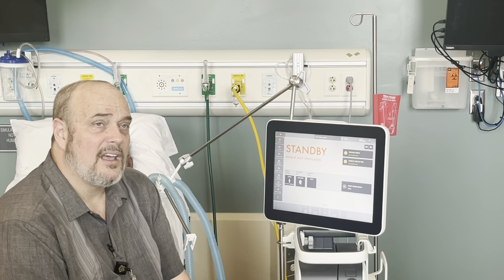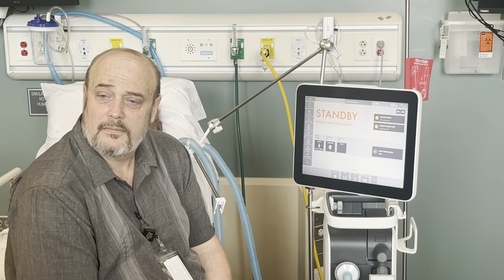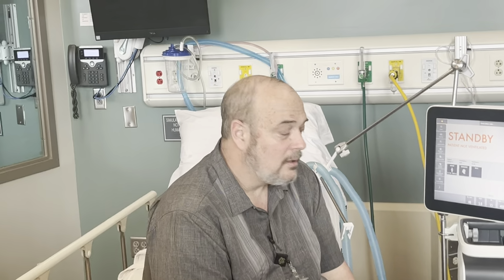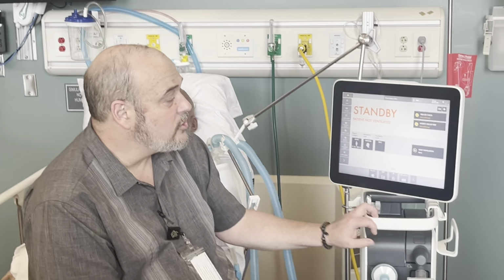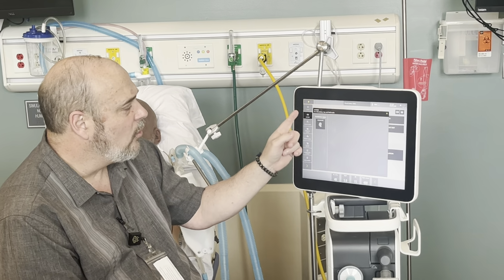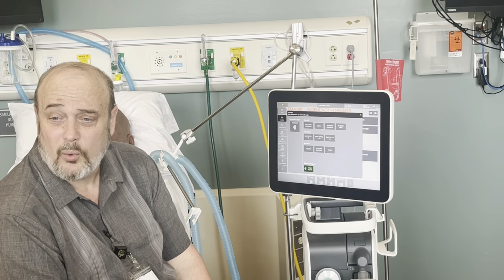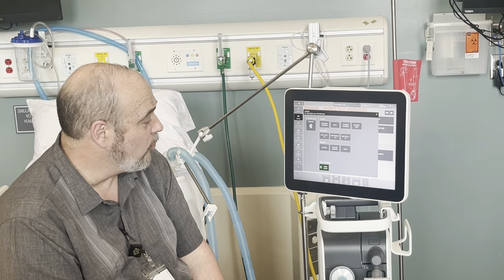Have you guys got any kind of lessons on ventilators yet? Not really, no. Okay. Just know on your I:E ratio, generally we're looking for something that's 1 to 2, unless you're air trapping, then we want something more, 1 to 3 or more. And we'll go more than that.